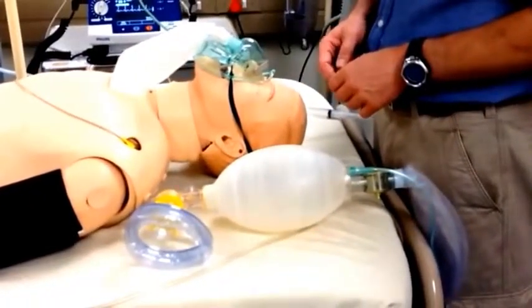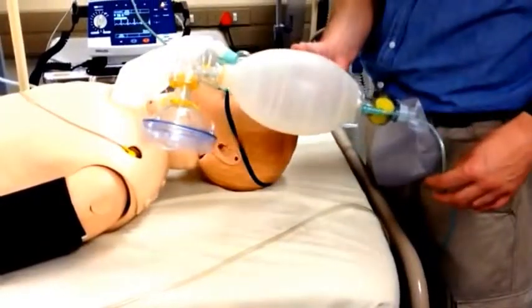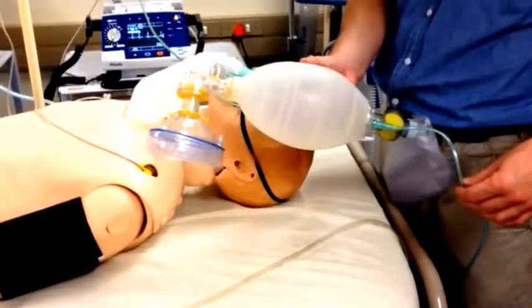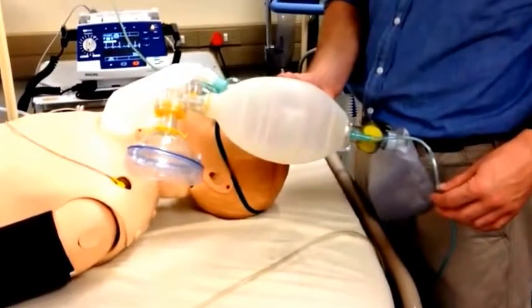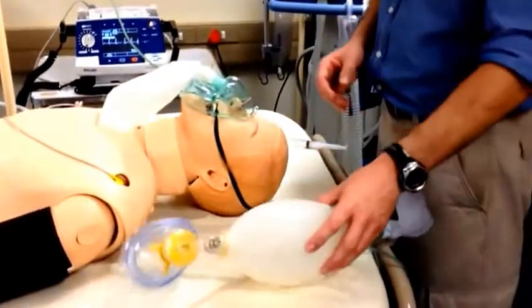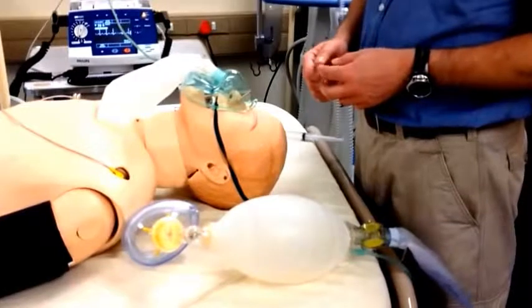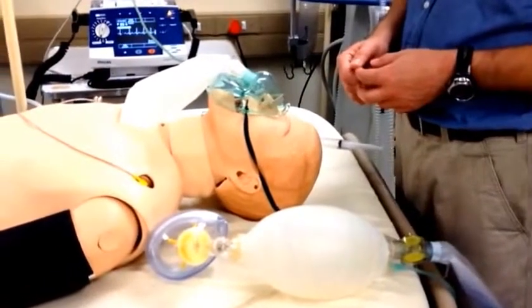In a patient with inadequate ventilation, assist their ventilation with a ventilation device such as the self-inflating bag valve mask device for approximately 8 vital capacity breaths. Once the patient has been pre-oxygenated, you can proceed with the induction and paralysis of the patient.